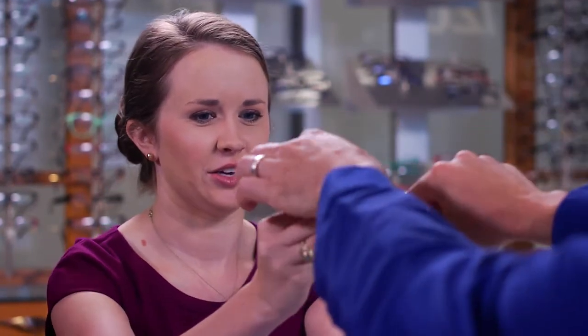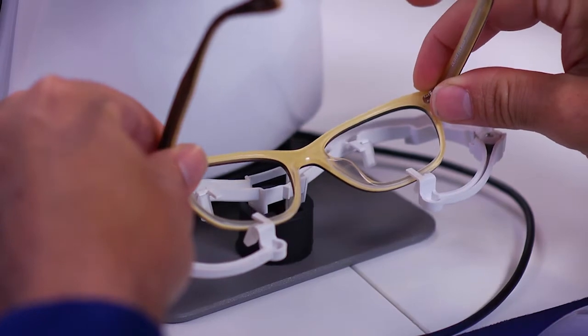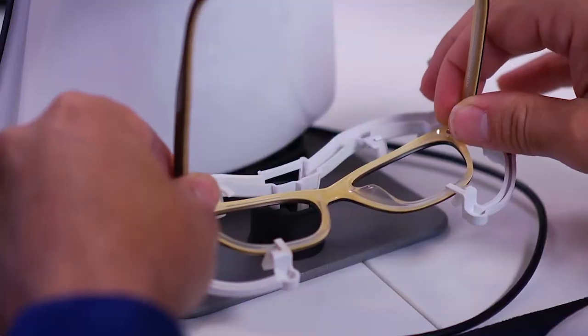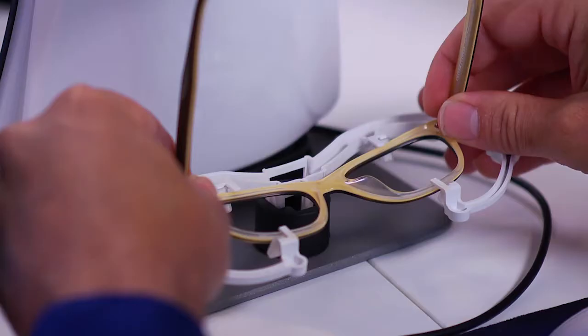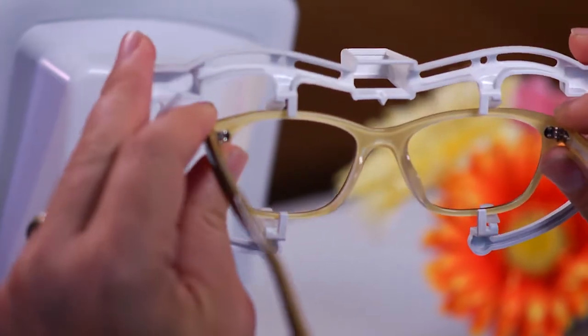When the patient's frame is properly adjusted, attach the clip to the frame. Open the arms, insert the bottom of the frame into the lower tabs, then gently pull the frame towards you so as to open up the clip arms so you can position the top of the rim in the upper tabs. Check that the rim is inserted all the way into the tabs. Center the clip on the frame using the center mark as a guide. Now we are ready for the fitting.